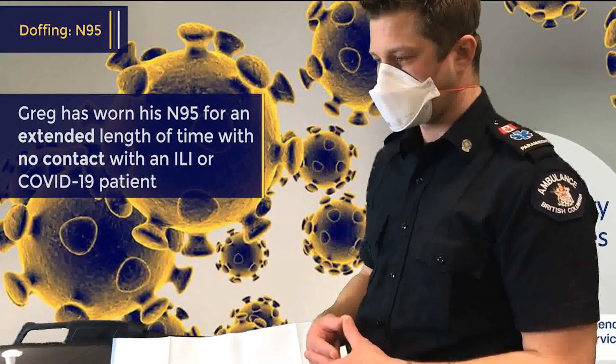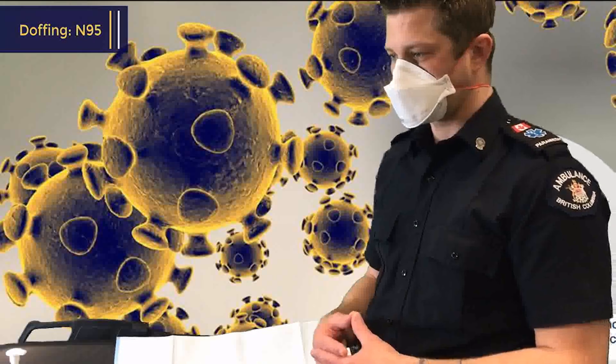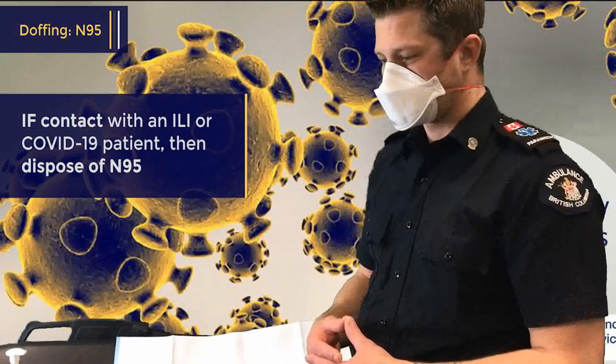He's not had any contact with a patient with ILI symptoms or COVID-19. If you've had contact with that type of patient, you should dispose of the N95 as normal and get a new one for your next patient contact.